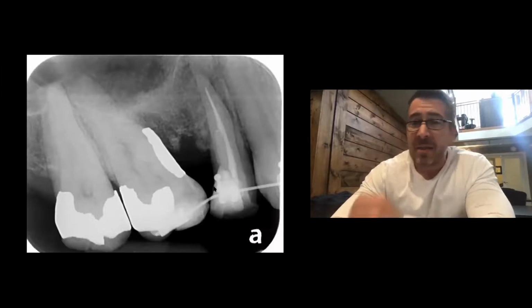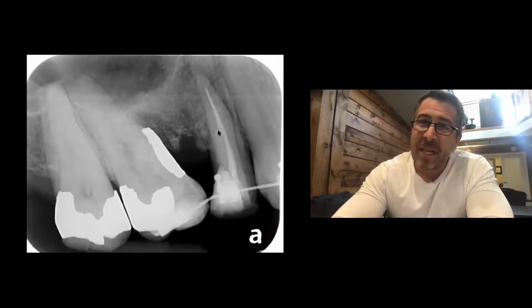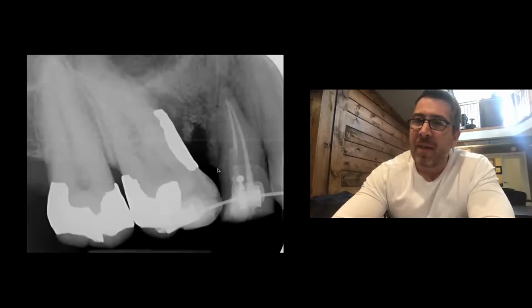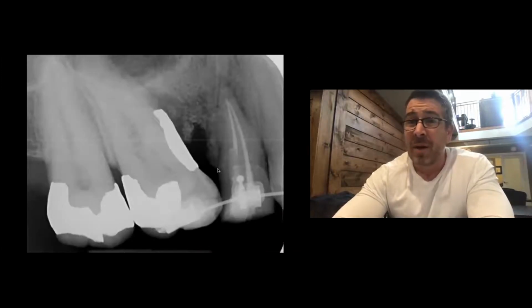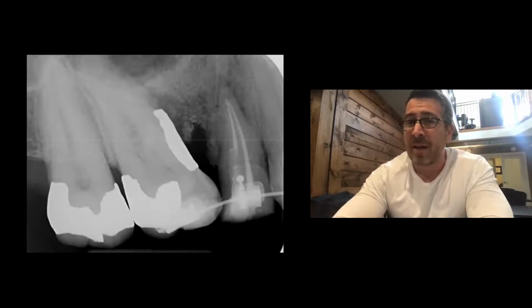And we actually did this case in our office here. I didn't do this restoration, but these are weird restorations on these teeth. But we did. We took this endo-treated 1-4 and we super erupted it and watch the interdental height of bone that's on the distal. So on the distal of that 1-4, watch how far that came down by super erupting the tooth orthodontically. That's the only way that I know how to change where that interdental height of bone is.